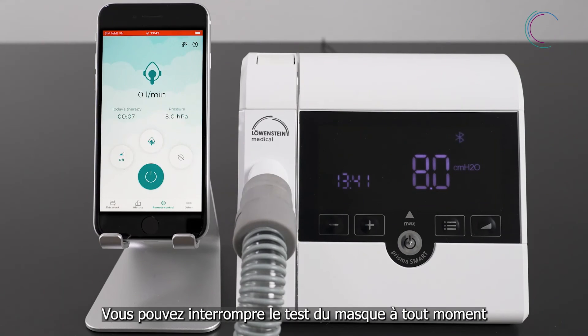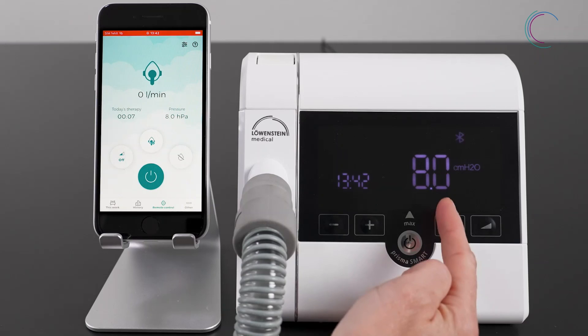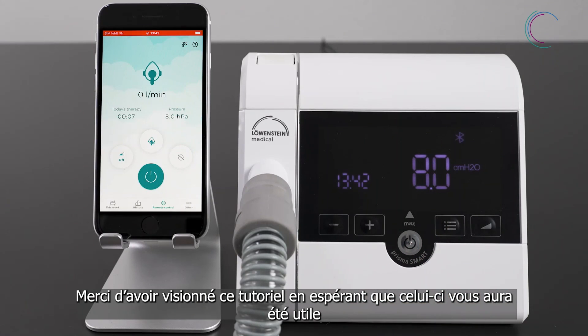You can also interrupt the mask test anytime during the test. After stopping the mask test, your therapy will start. And now have fun with Prisma App.